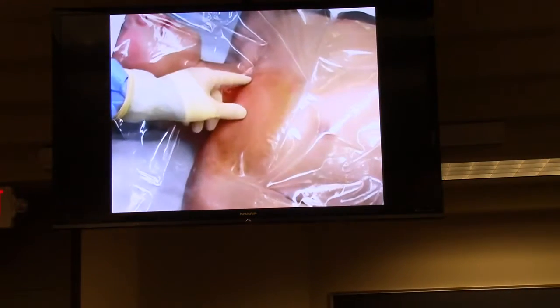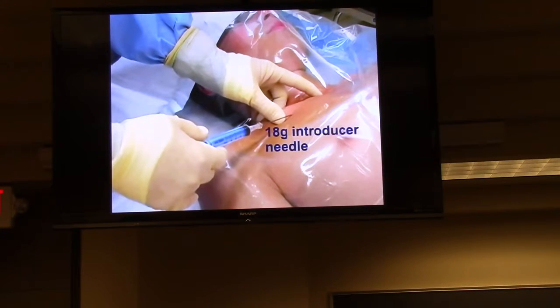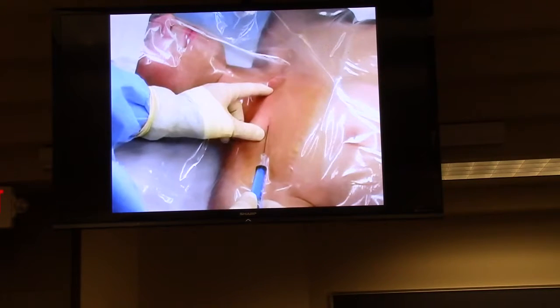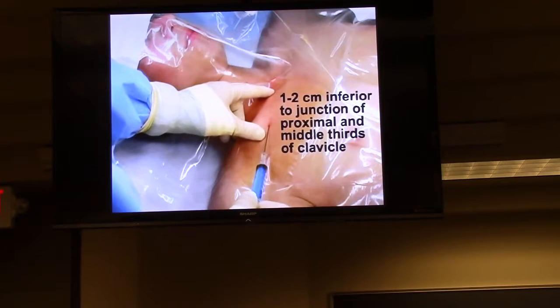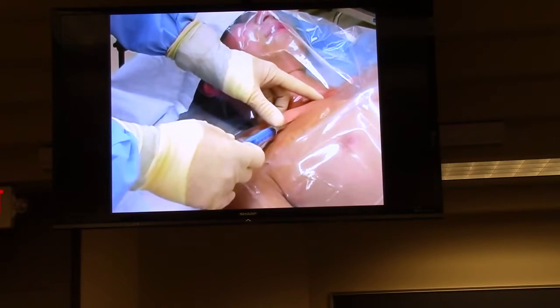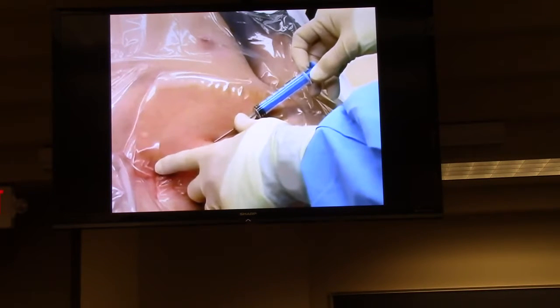Place the index finger of your non-dominant hand in the suprasternal notch and your thumb on the bend of the clavicle. Insert the 18 gauge introducer needle attached to a 5 milliliter syringe at a point 1 to 2 centimeters inferior to the junction of the proximal and middle thirds of the clavicle. The needle should be held at a 5 to 10 degree angle relative to the chest wall and advanced until it contacts the clavicle. Walk the needle down the bone and toward the subclavian vein.